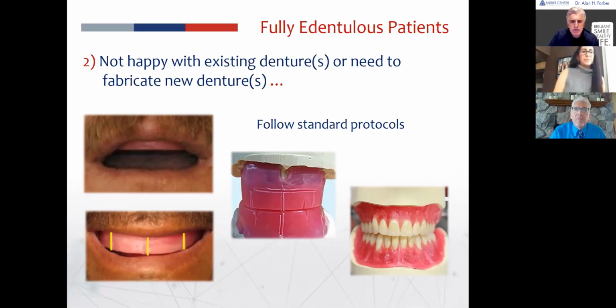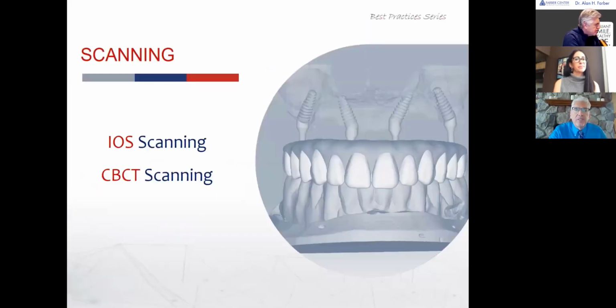What these marks are here, the midline obviously, is very good to mark. It gives you a good visual as well. The other marks are the canine marks. Buccal corridors actually don't start at the midpoint of the canine, but you mark the midpoint of the canine, and we're typically going to go 3 millimeters back and start creating a buccal corridor. So the lines on the models are showing your midlines. The maxillary model is showing those other 2 lines, the height of canine position. That also helps us to get a mold to fit within that parameter. Hopefully that answered the question sufficiently.